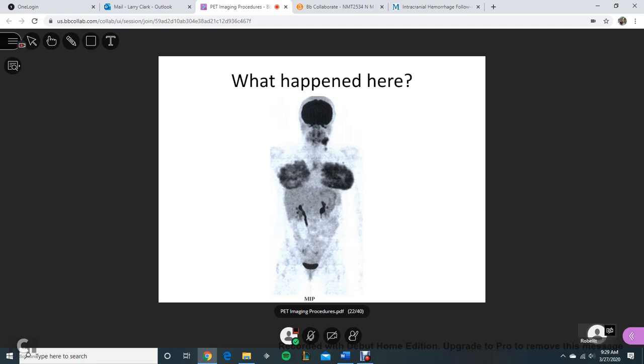Patient ate something. No, you have a female with lactating breasts. What about the liver? It looks like it's empty. The gallbladder. That's the kidney. That's kidneys, these two here. I was going to say the liver specifically. Yeah, this is the kidneys, and then they're going to empty out into the bladder.